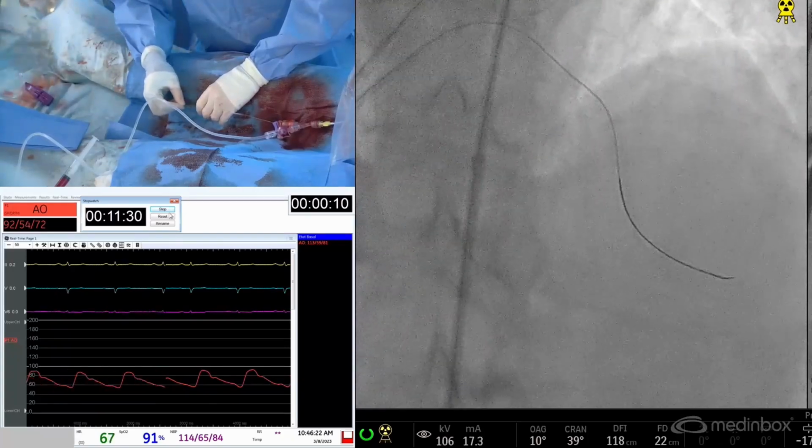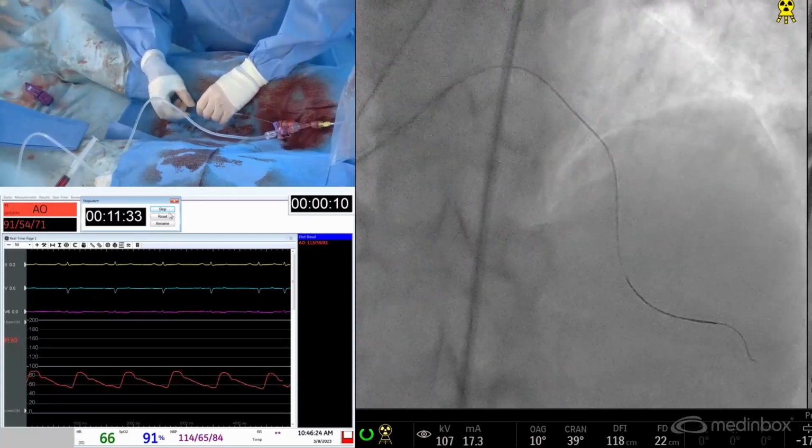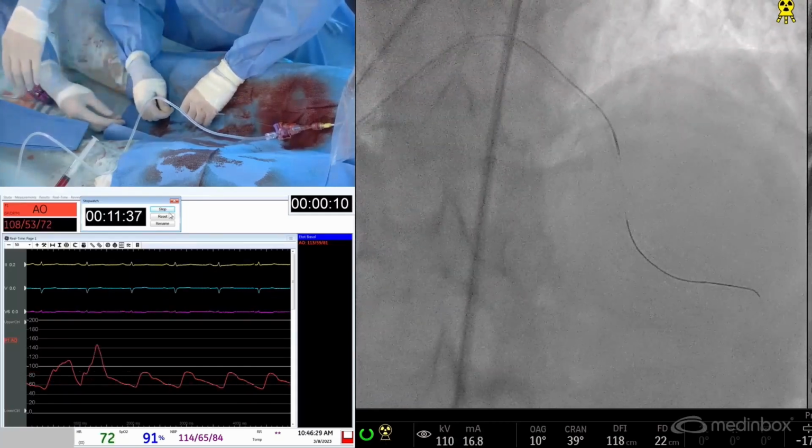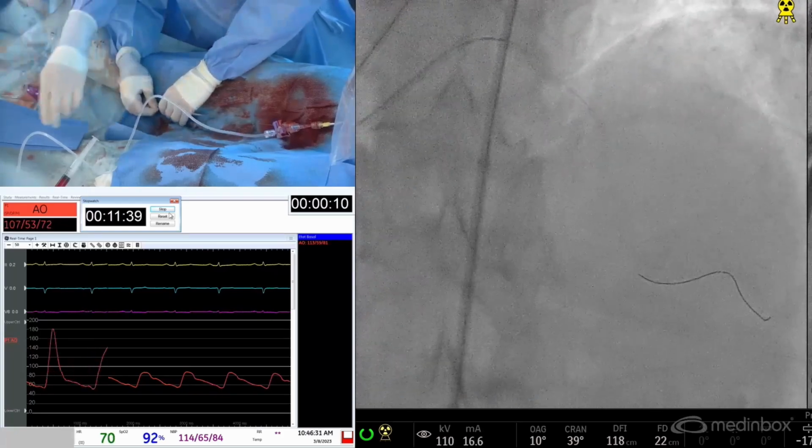We're going to exchange out as we did previously. Air gliding it out. That's perfect. C'est beau ça. Ouvre ton Y. Ouais. Just, laisse-le comme ça.